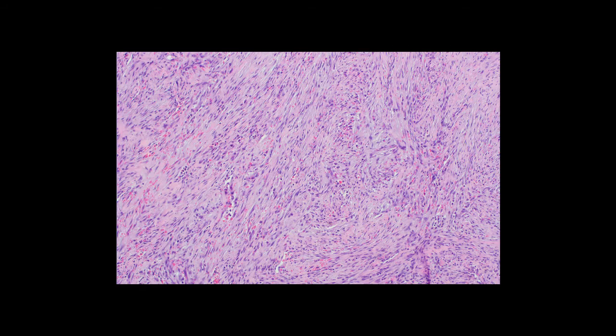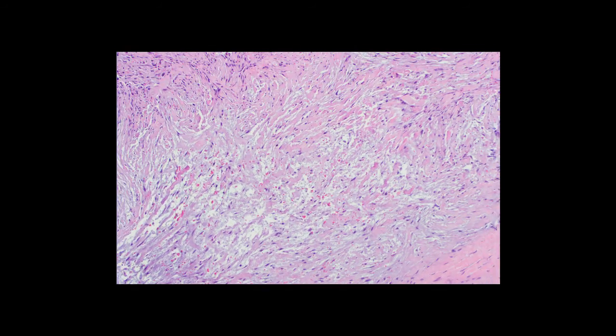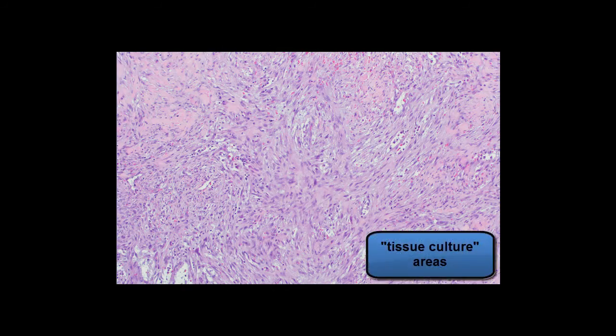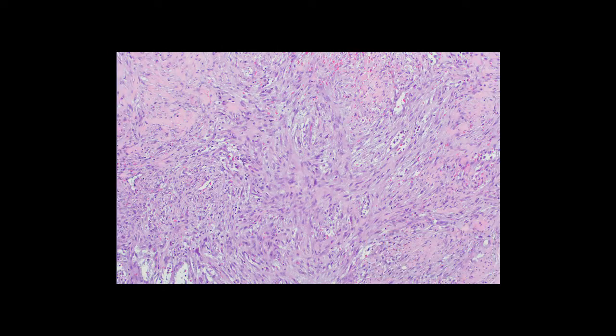At higher power, you can appreciate that the lesion is composed of spindle cells that are arranged in short fascicles in many areas. But in the more hypocellular areas, you can appreciate a very myxoid background as well as some dense hyalinized collagen bundles. Focally, more feathery or tissue culture-like areas can be appreciated, and this is a classically described feature of nodular fasciitis.